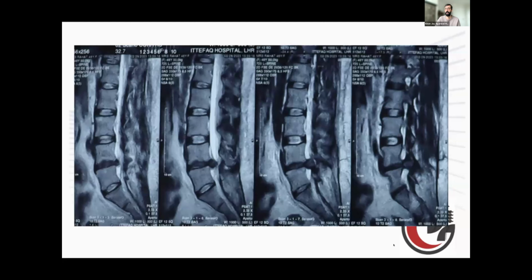There's a great question in the chat actually from Santiago Montenegro asking, part of the success in interbody fusion relies on the rate of bony fusion integration around the implants. What are some techniques that you can do endoscopically to favor this process? Drive your camera into the disc space and visualize the entirety of the discectomy.